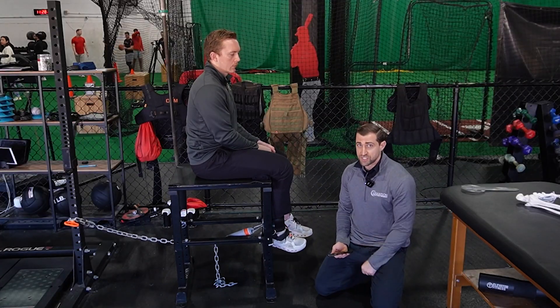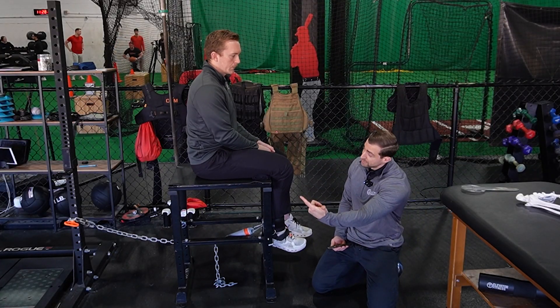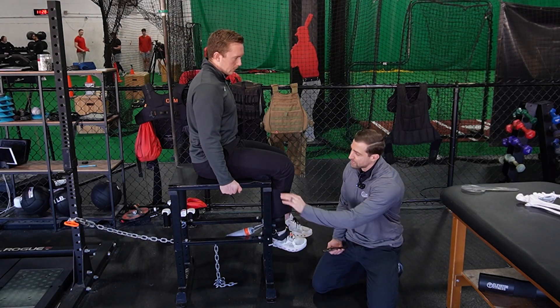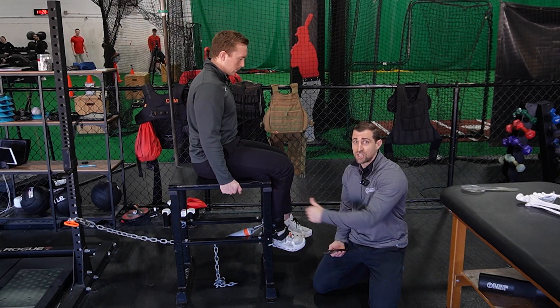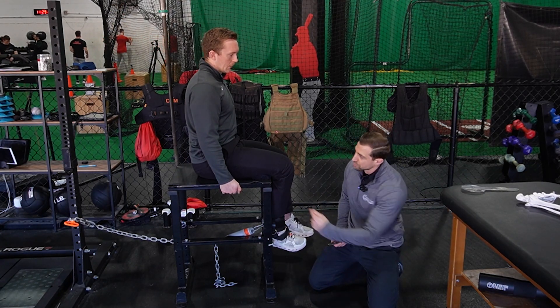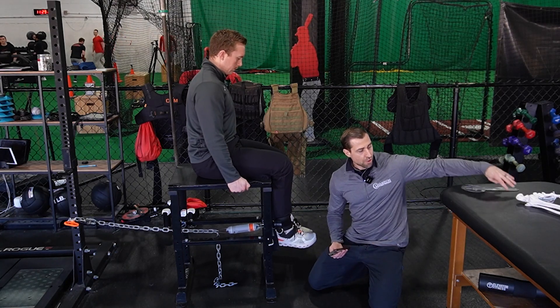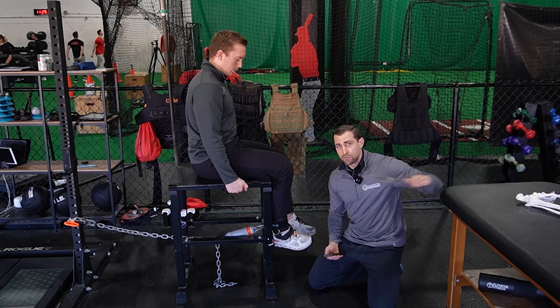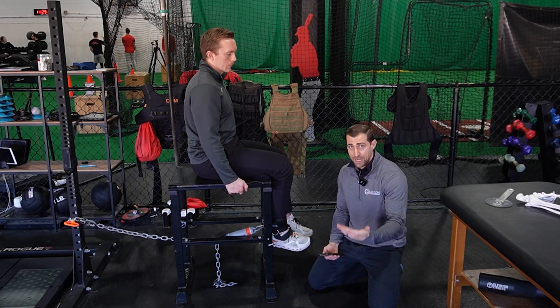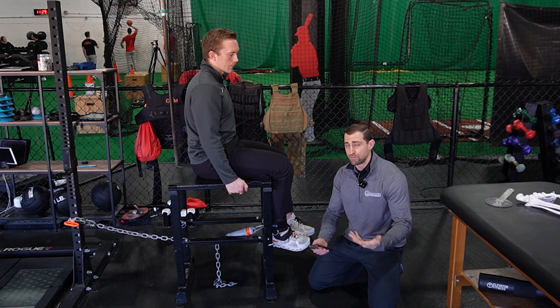A couple of specifics: we'll have Jacob sitting up nice and tall with good posture. We're going to have a towel underneath the knee — one reason is we don't want pressure up against the leg, because if something hurts while the athlete is doing the test, they're probably not going to push that hard. We also want to be at 90 degrees; if you have a goniometer, you can use that to measure it.